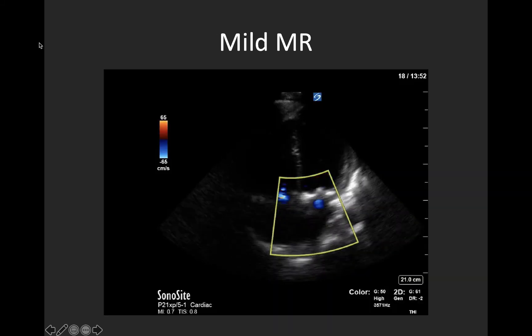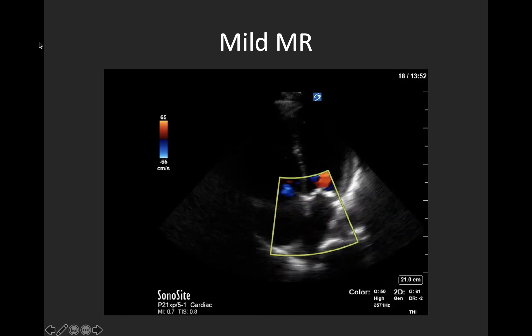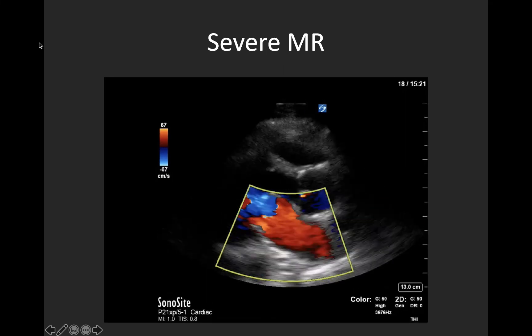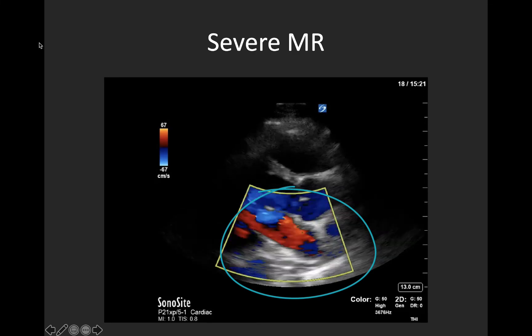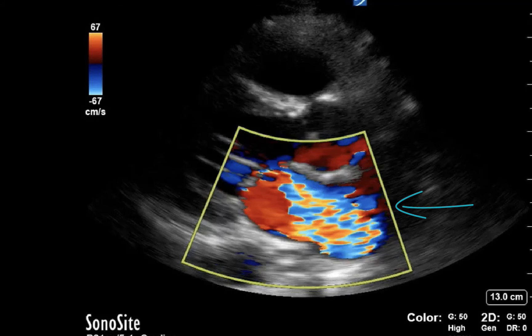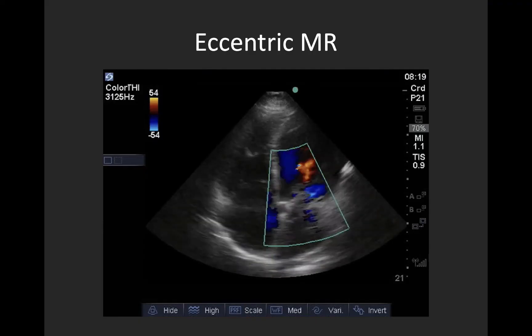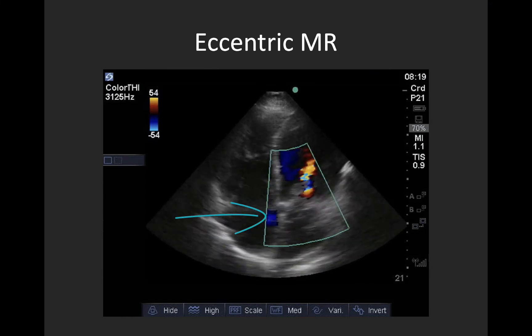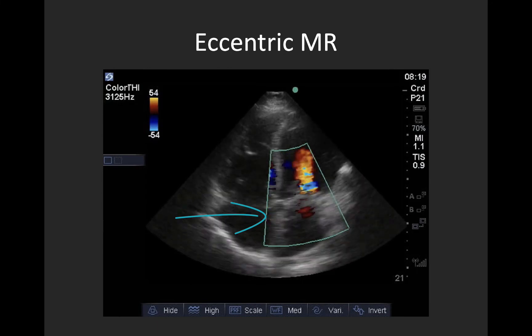Here we have an apical four-chamber view demonstrating mild mitral regurgitation — that small central blue jet expelled into the left atrium during systole. Here we have a parasternal long axis view with severe MR, and you'll note the huge jet of blue and aliased flow that almost fills the whole left atrium and clearly hits the back wall. It can be helpful as you're learning to freeze your clips and scroll through them to identify the regurgitant jet. And here we have an example of eccentric MR — that small blue jet running down the interatrial septum — where we're likely significantly underestimating severity.